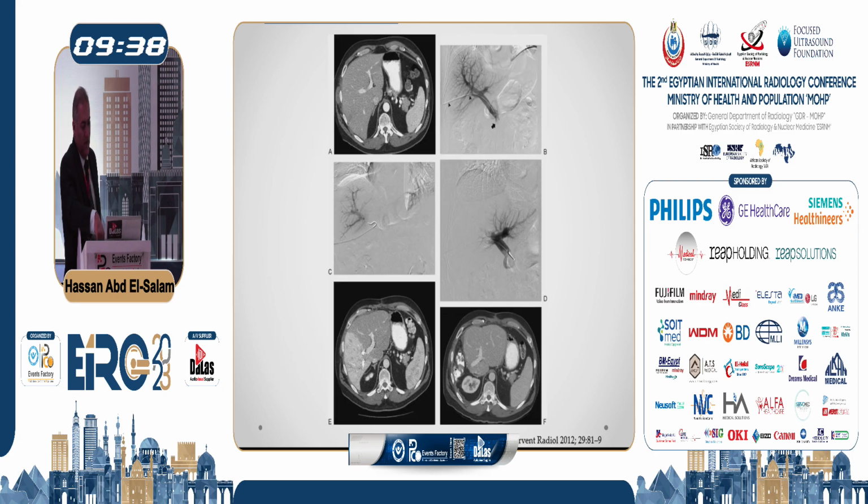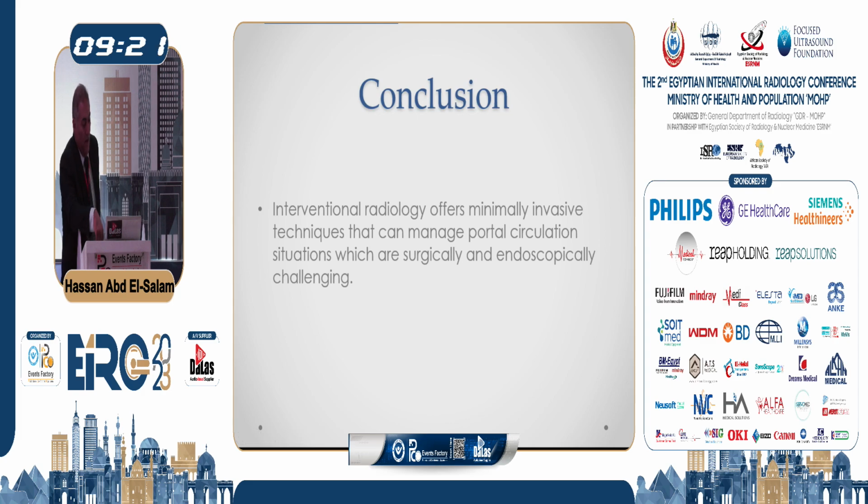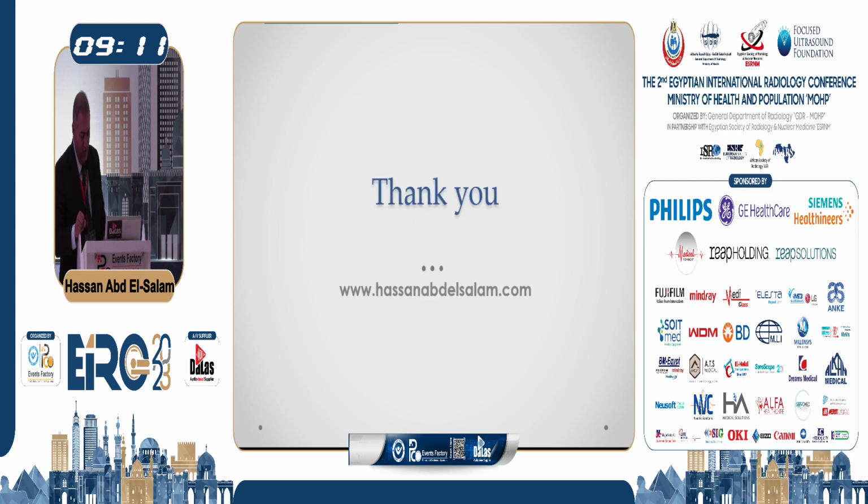So this is the portal vein angiogram. We are going from the right side, and then we've embolized the right side. You can see the hypertrophy of the left lobe. In conclusion, interventional radiology offers minimally invasive techniques that can manage portal circulation situations which are surgically and endoscopically challenging. Thank you very much.